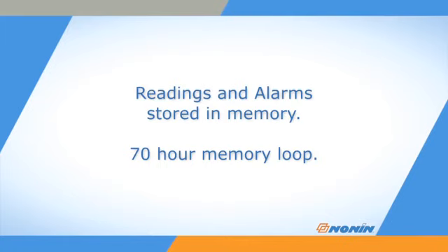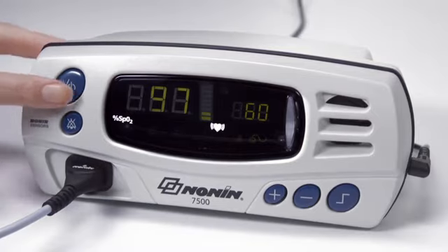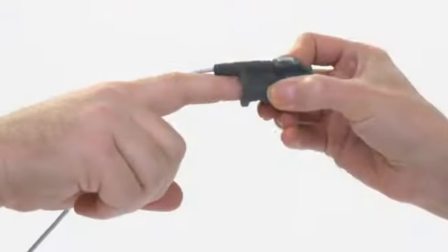Stored data is retained for the last 70 hours of use and then records over the oldest data in 4-minute segments. Data can be downloaded and analyzed on Nonin nVision software. When you are ready to stop using the oximeter, simply press and hold the on-off button until the oximeter turns off. Hold for 1 second in normal function and 5 seconds if the oximeter is in patient security mode. Then you can unplug and remove the sensor.